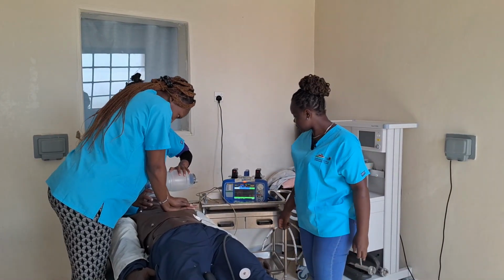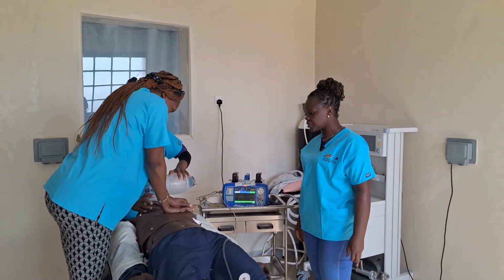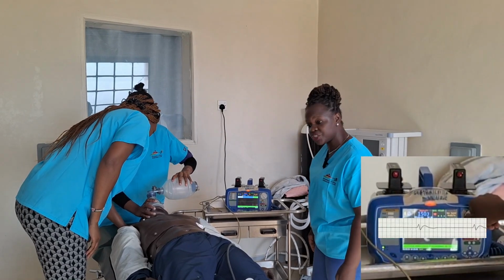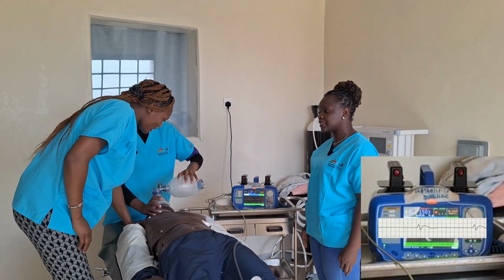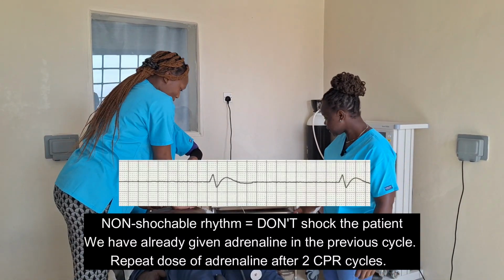So team, it's now 2 minutes since we continued the CPR. Jackie, please check for a pulse. I'm looking at the monitor. We have an unshockable rhythm. Do we have a pulse? No pulse. So we have a PEA, continue CPR.